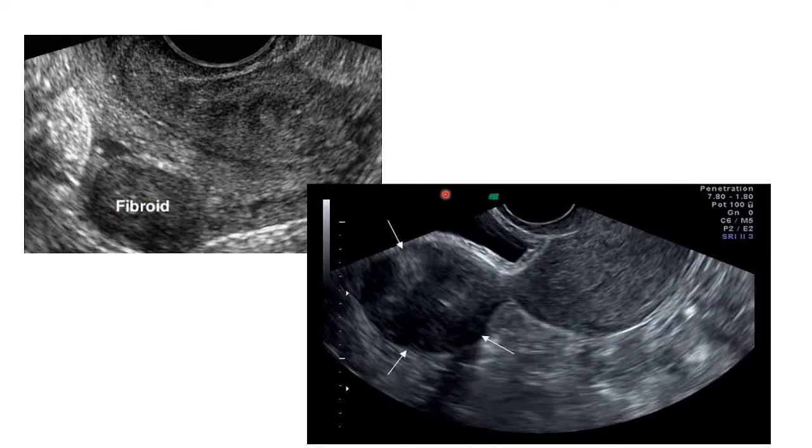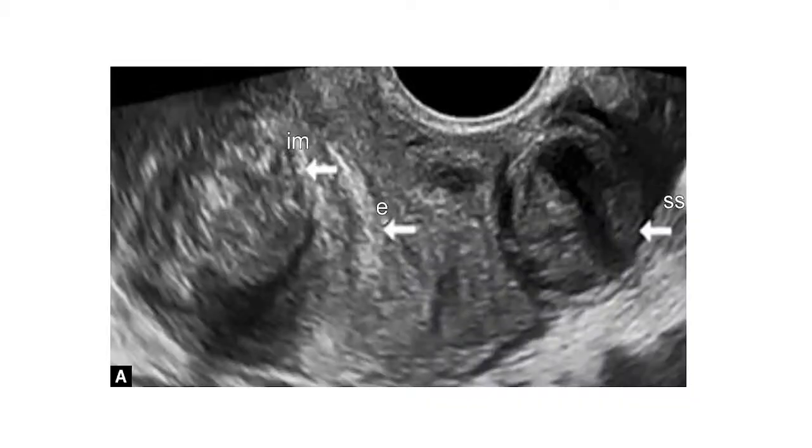So here we have a fibroid that is attached to the rest of the uterus by a stalk again. So I've spoken about this. This is what is called a pedunculated fibroid. It's held by a stalk. So that's a pedunculated fibroid. So again here you can see this is another fibroid. So this is another fibroid there. So you can see all of that is a fibroid.